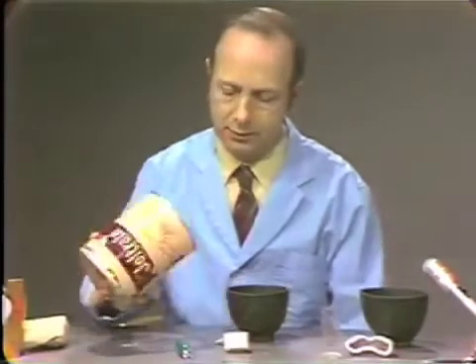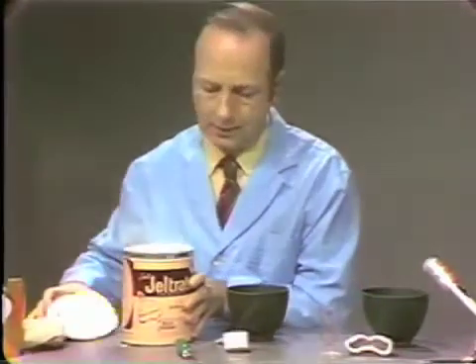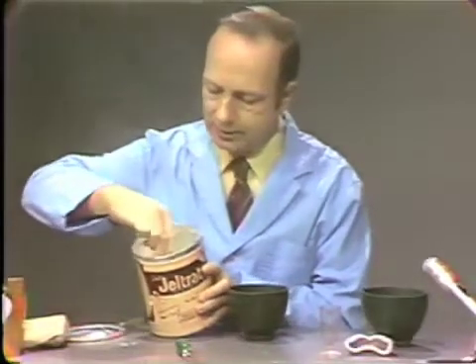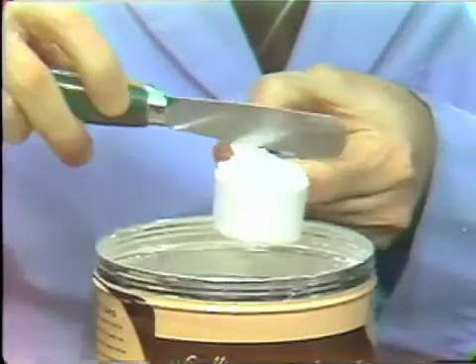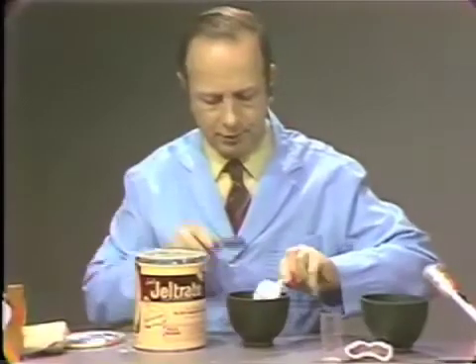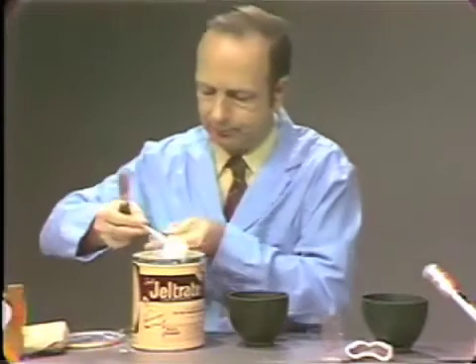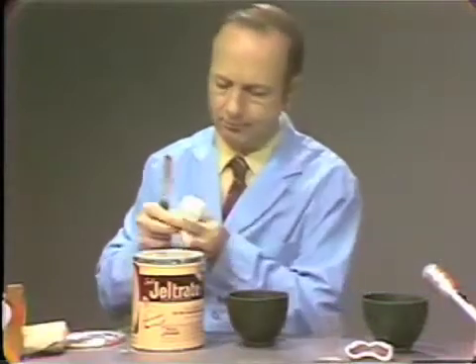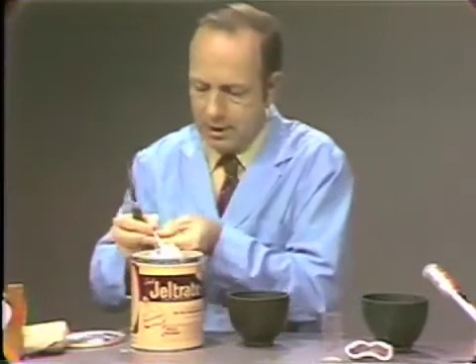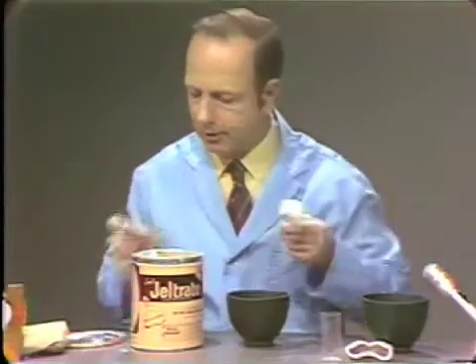Then we will aerate the sample of alginate. The scoop is lightly placed in the alginate can. The cup is gently tapped with the spatula to remove large voids and then struck off flush. We will use three of these scoops because we are using three portions of water. Do not pack the scoop tightly into the powder, otherwise you will use too much powder and you will get too thick a mix.